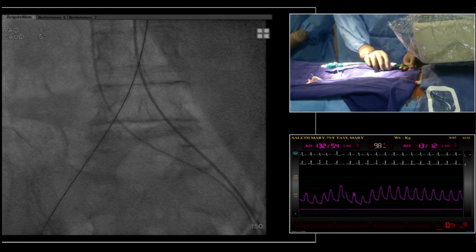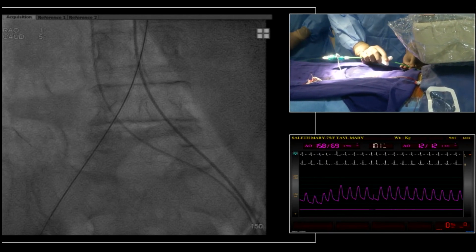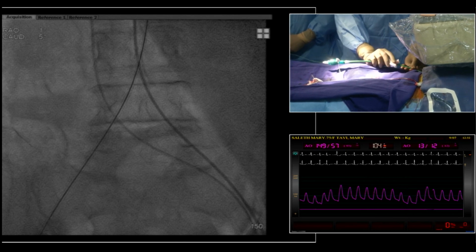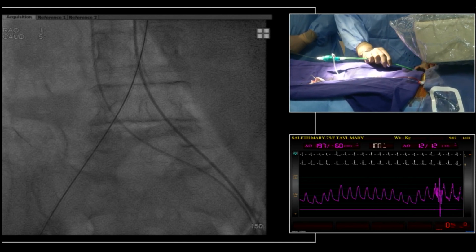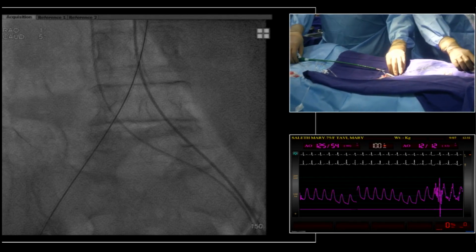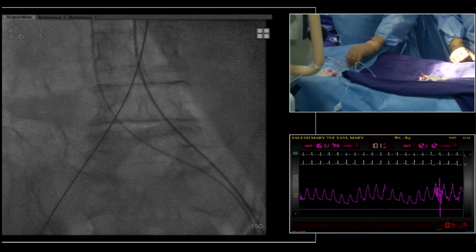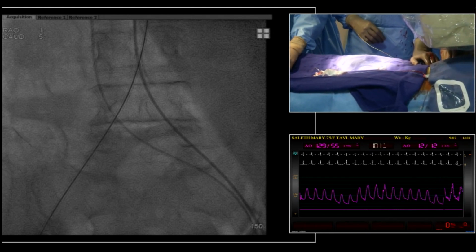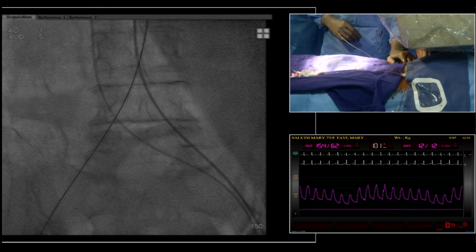No, we didn't. We will use a dilator. Can you show down? Yeah, we see that. Give me the dilator, so it makes it much better. Yeah, give the dilator. Okay. And also very important when you push this kind of sheath, which is activated by water, is to have something very slippery.